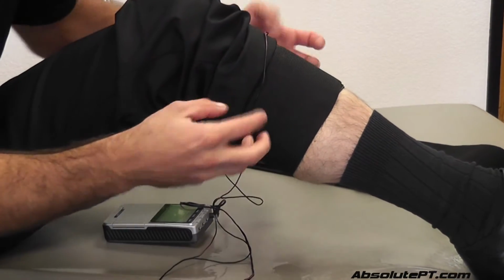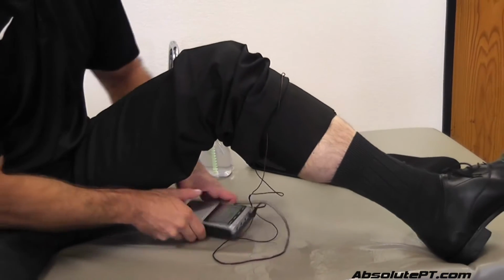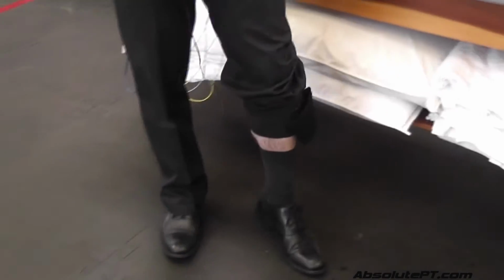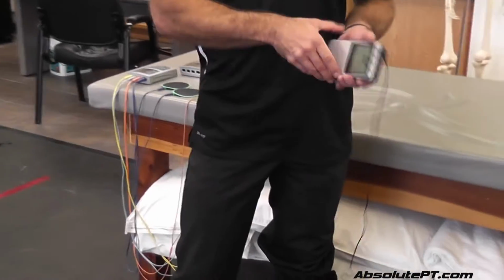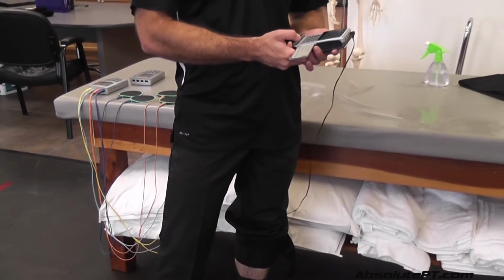So if your pads are stinging, your straps may be too loose, or your pads aren't wet enough, or your skin's too dry. So that is on. Calf's kind of a rough thing to stim if you aren't standing on it, because your muscles will contract so hard you can't absorb it. You can't counterbalance it. But if I'm standing on it, at least with this stim machine, it should be okay.